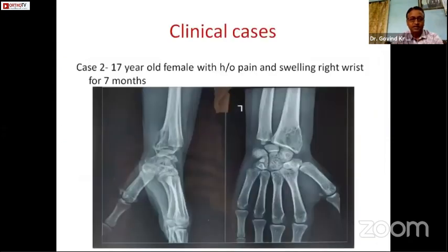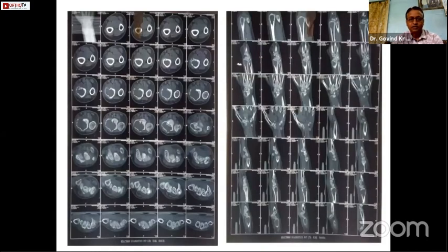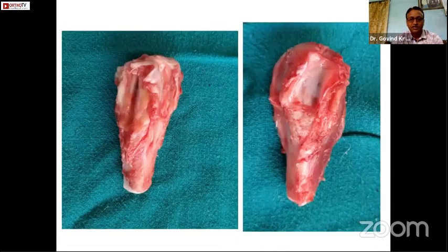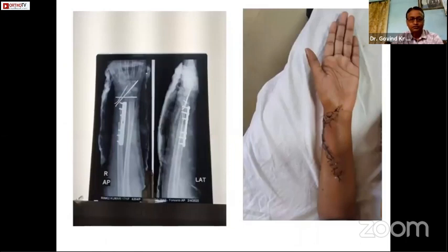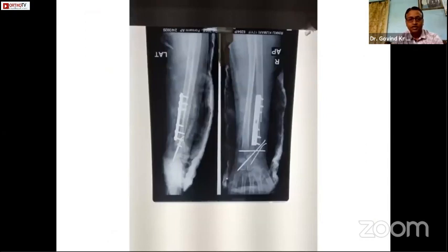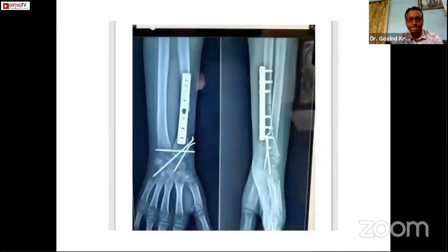This is another case — a 17-year-old female with a history of pain and swelling. These are the excised tumor, intraoperative views, post-op images, and follow-up. There is a gap at the radio-fibular side, which will lead to non-union.